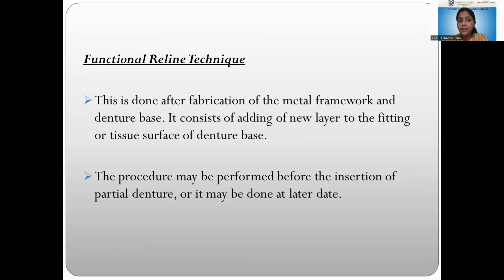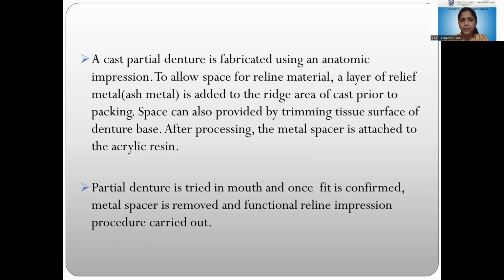Coming to the next technique, that is the functional reline technique. This is done after fabrication of the framework as well as the denture base. This can be done after the insertion also. We will add a new layer. A relining is done after the fabrication of the prosthesis. So the procedure can be performed before the insertion or after a few days of insertion.